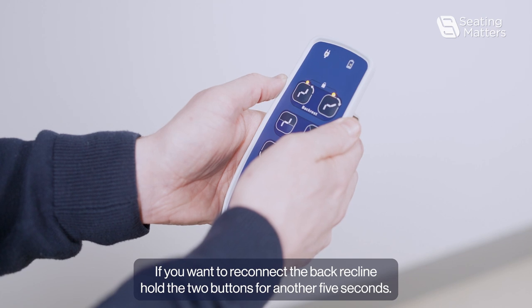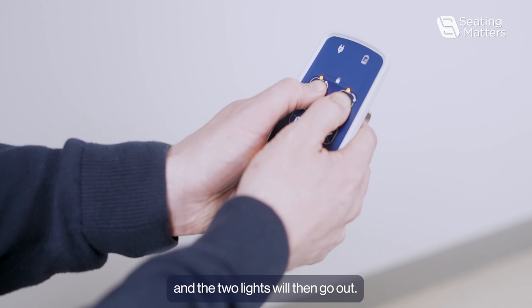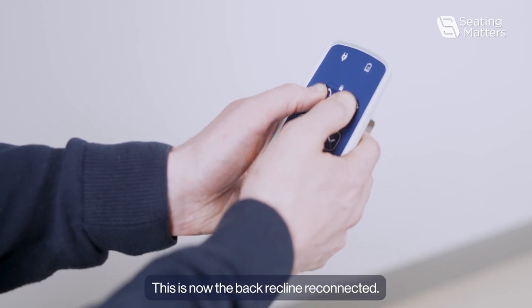If you want to reconnect the back recline, hold the two buttons for another five seconds and the two lights will then go out. This is now the back recline reconnected.